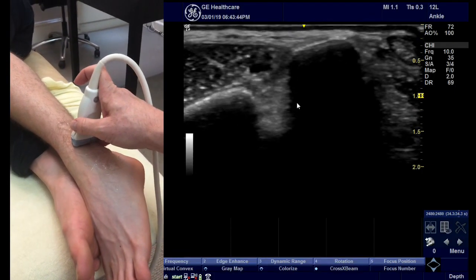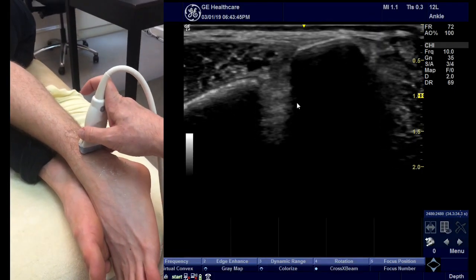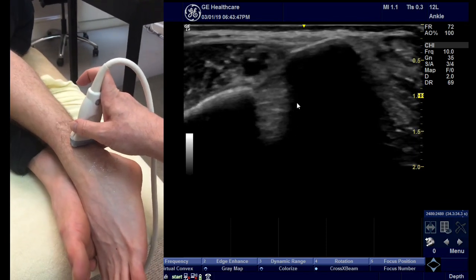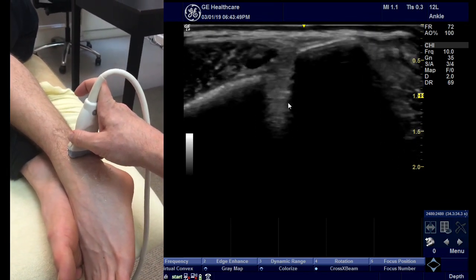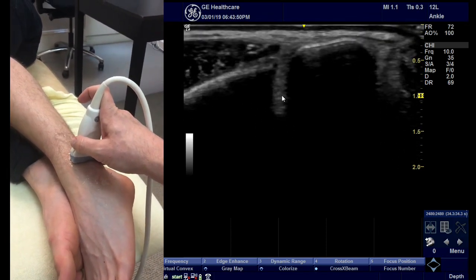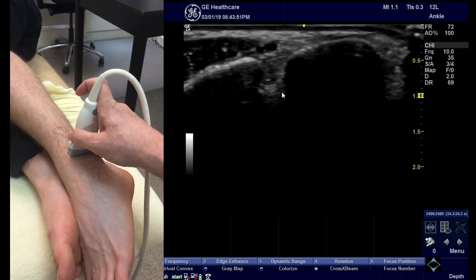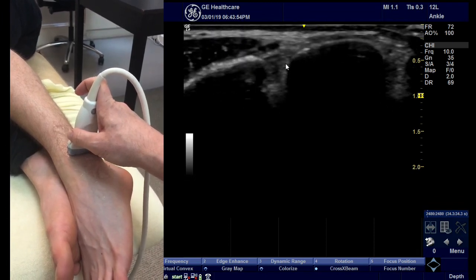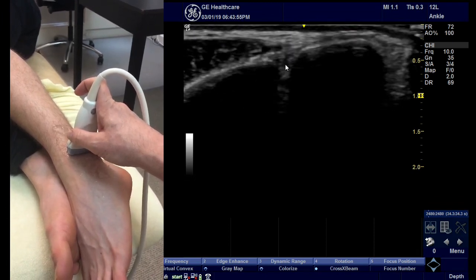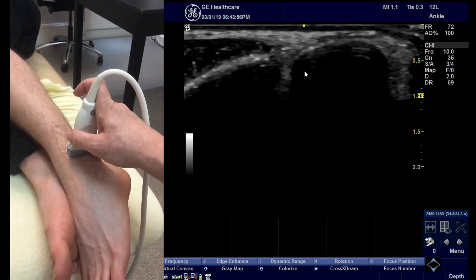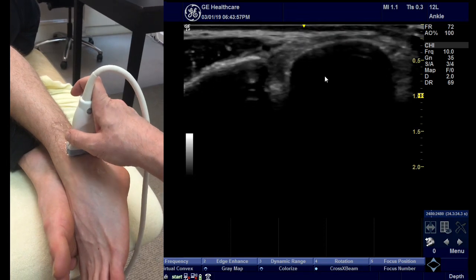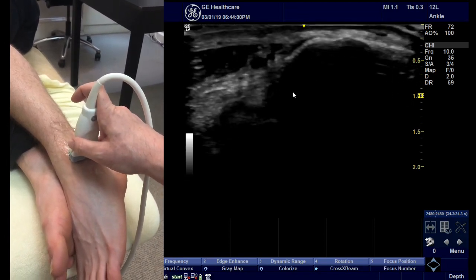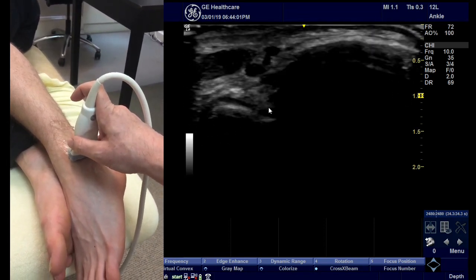Following the fibula down in short axis, you will see the tibia coming to meet it. Where they kiss, this is the syndesmosis. You keep following the fibula until the talus appears.